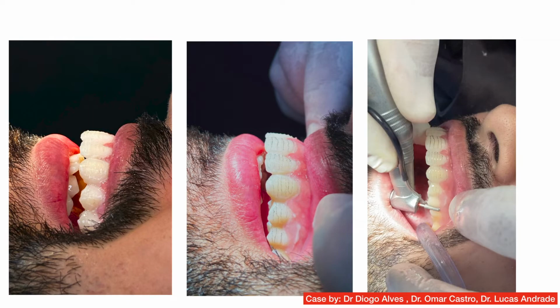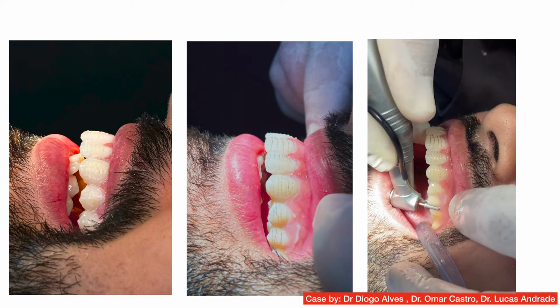So to create 10 minimally invasive composite veneers going from the upper left second premolar to the upper right second premolar, the motivational mock-up was removed and a silicone index of the ideal minimally invasive prep guide was made using addition silicone. The mold was then filled with bisacryl resin and placed onto the patient's teeth with the goal of reducing the enamel in order to be as minimally invasive and precise as possible during the preparation.